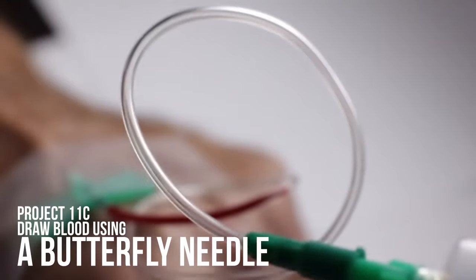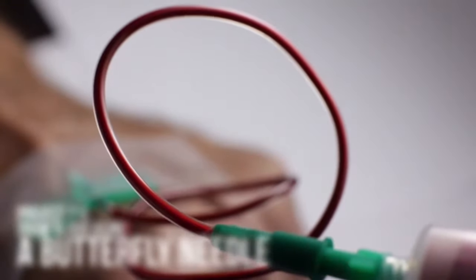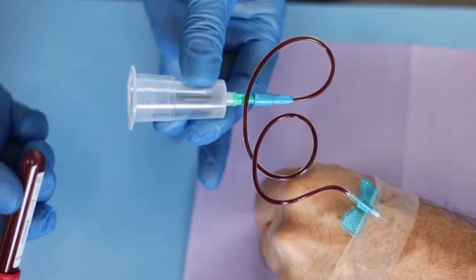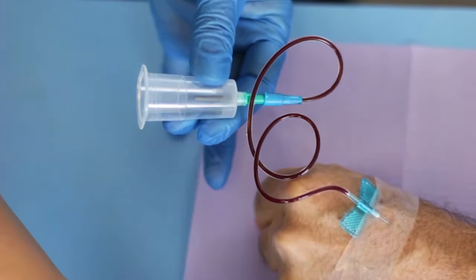Project 11c: Draw blood using a butterfly needle. Using the venipuncture trainer to simulate drawing blood and follow the steps as if in a real clinical situation.